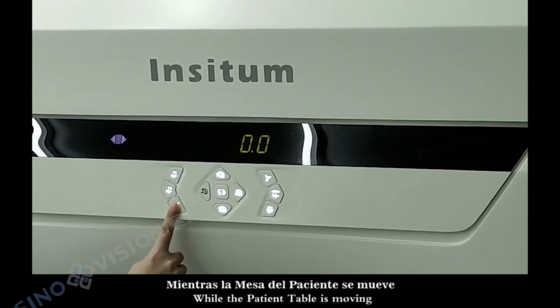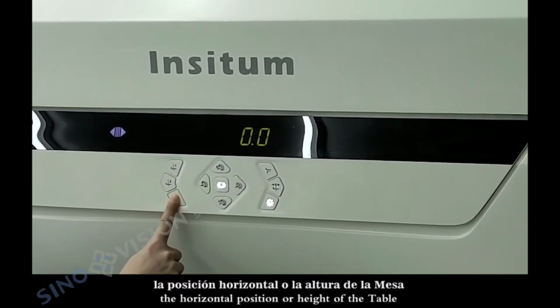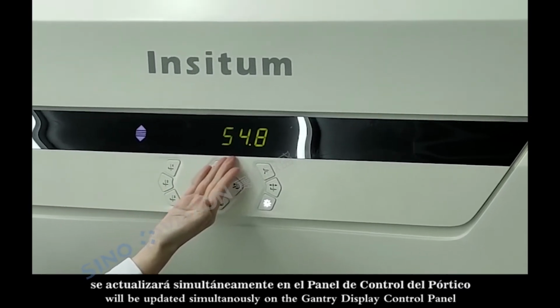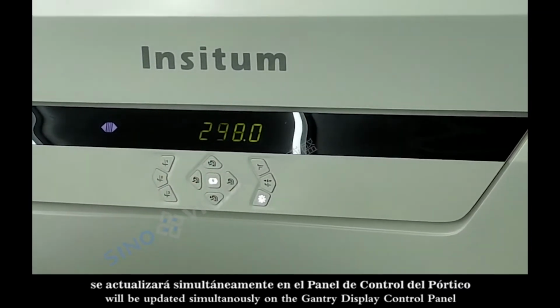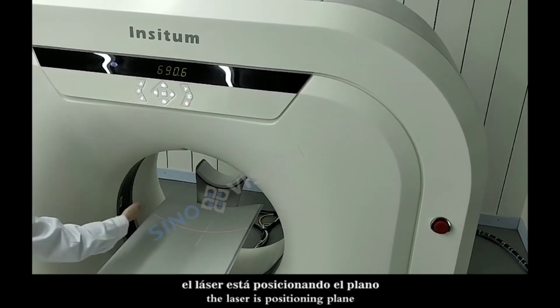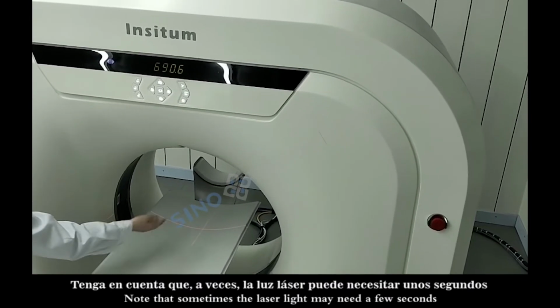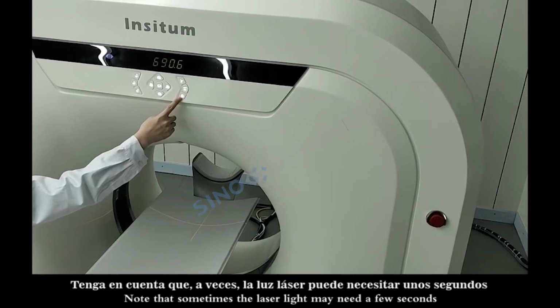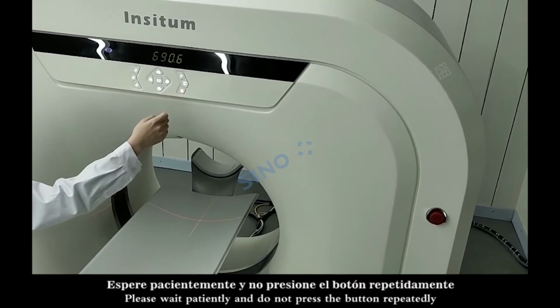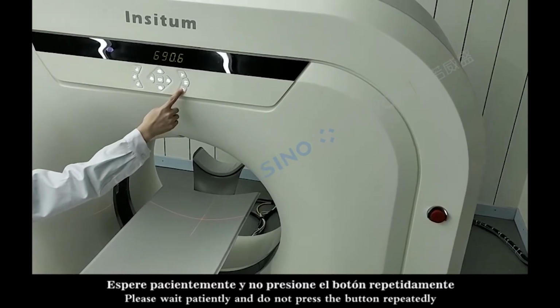While the patient table is moving, the horizontal position or height of the table will be updated simultaneously on the gantry display control panel. This is the laser alignment light button. The laser is the positioning plane. Note that sometimes the laser light may need a few seconds to light up when you press this button. Please wait patiently and do not press the button repeatedly.